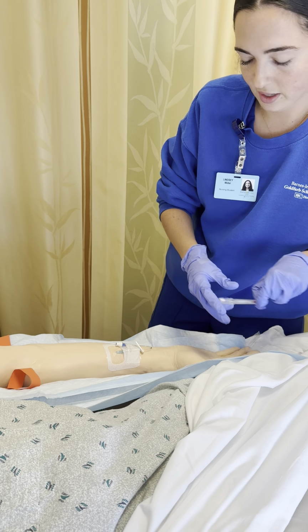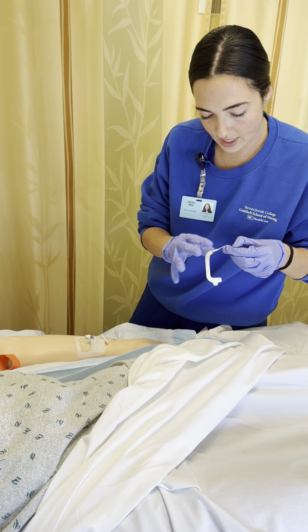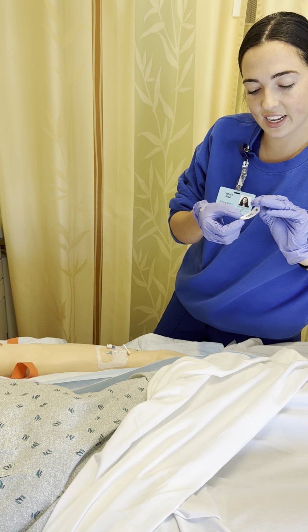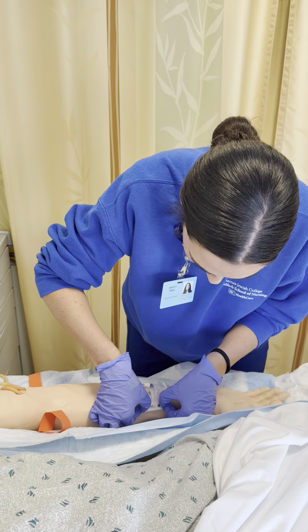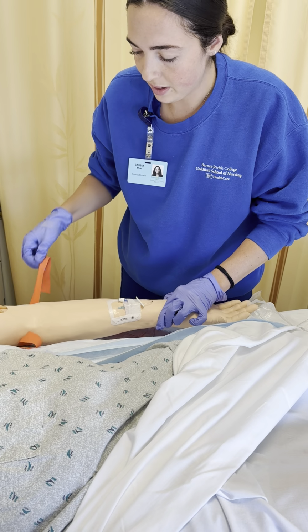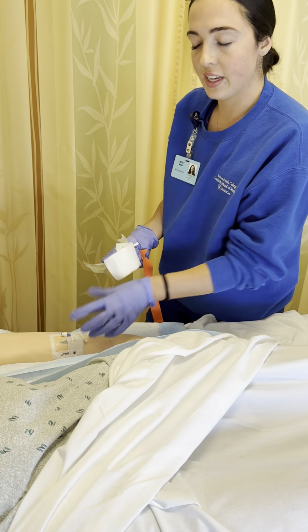I'm going to go ahead over there. I'm going to take this label on the side and I'm going to date it and put my initials on here. And I'm going to put it on this side here. Alright, I'm going to remove the tourniquet from underneath the arm. And the IV is now placed.